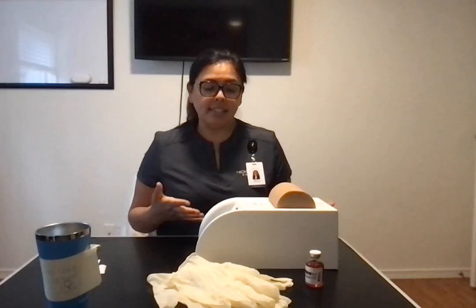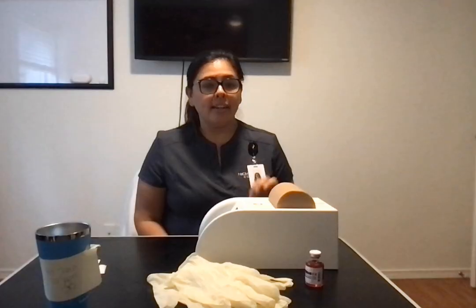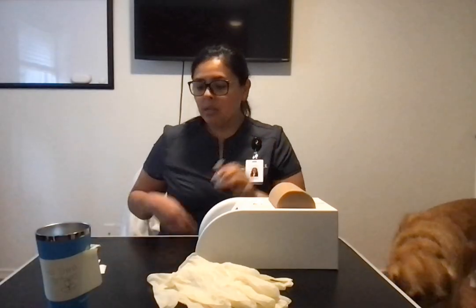After the patient has given consent to this test, next I'm going to verify again that the medication is for tuberculin 5 TUs per 1 ml. So I'll just have to get 0.1 mLs drawn up for the medication. I think I misspoke a few moments ago. So this is tuberculin 5 TUs per 0.1 mLs. So I'll be giving the patient 0.1 mLs.